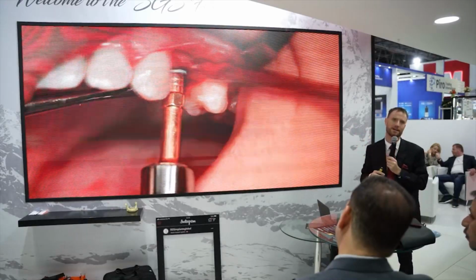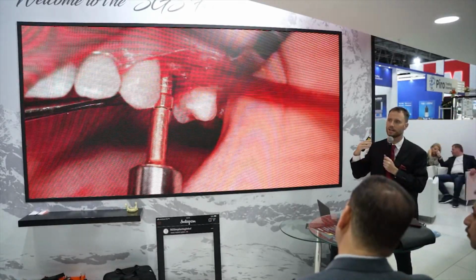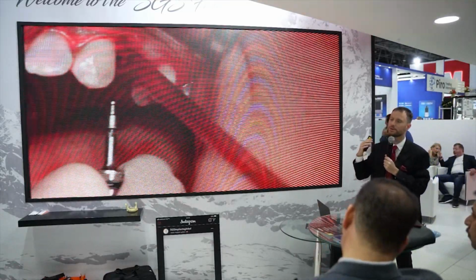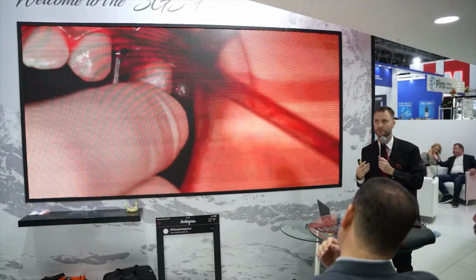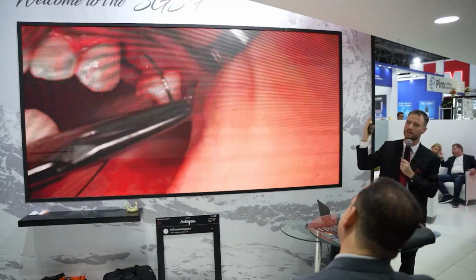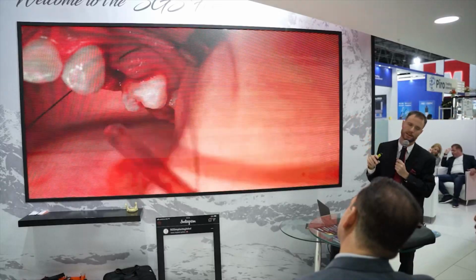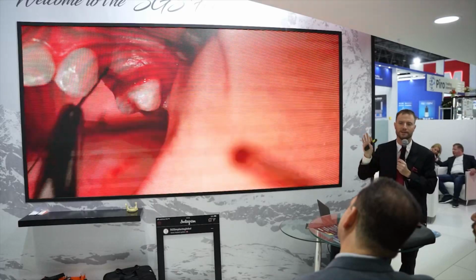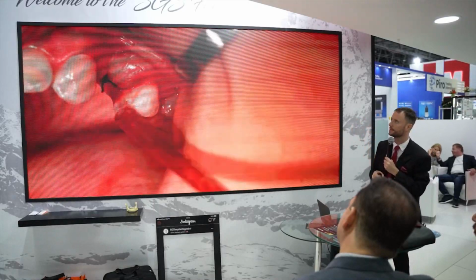The surface treatment we had earlier, last year and the year before, lectures about that. It's a double combined surface treatment including hydroxyapatite that is really unique and is ensuring us very quick bone healing and also integration. As I told you, in this case we did a crestal incision. We're going to place a cover screw and we're just going to do a very small suturing. Actually today I would suture it thinner and do it with, let's say, 5.0 suturing. Having all pros and cons, I prefer to have even thinner sutures today.